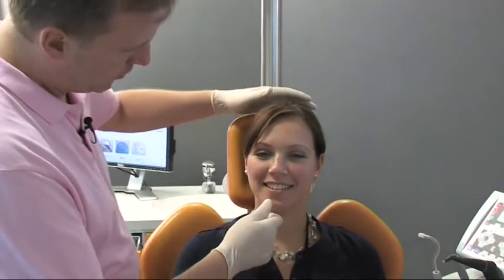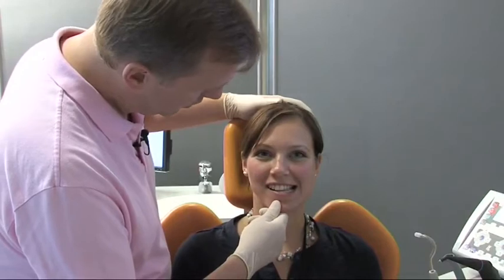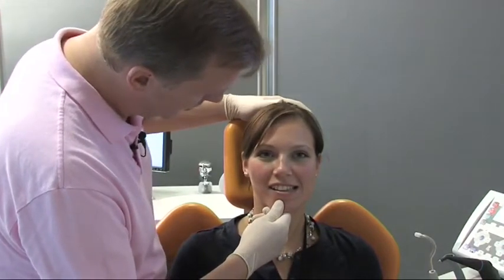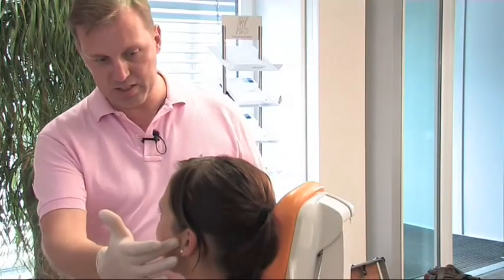Now we have clinically examined you and determined that you came with pain here in the joint on the left side. We have done many tests on you, around 20, and also determined that some particular tests were painful. A short while ago, I moved your lower jaw to the left and then pressed here. And when I pressed there, it was always painful for you, exactly like the pain which you came to us with. That means we now know that you are not imagining this pain.